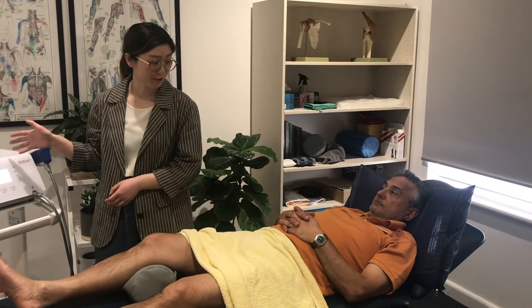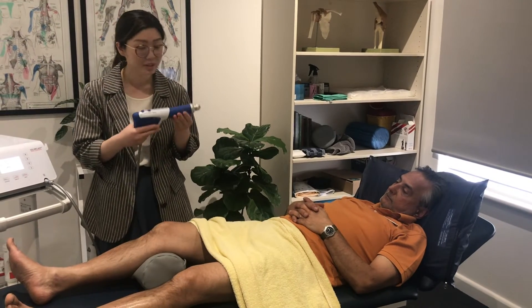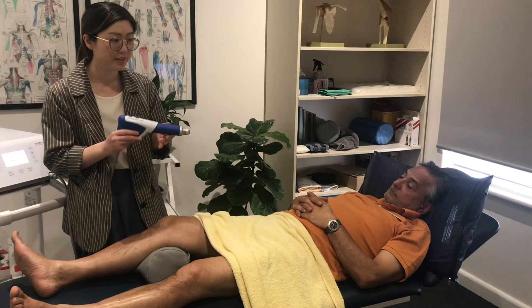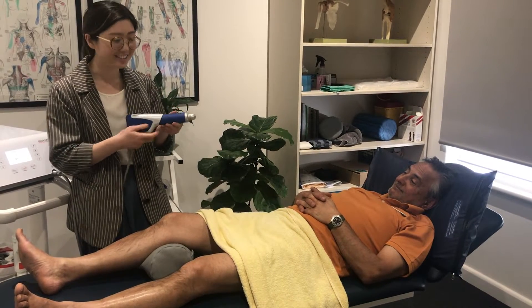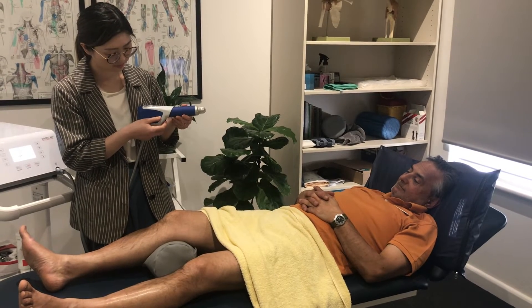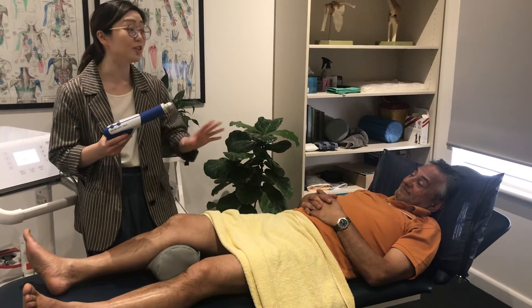This is our shockwave machine, and I'm just going to demonstrate now. This is how we apply it onto the joint or the tendon itself. I'll demonstrate what it sounds like because it can be quite loud. So it sounds like a little jackhammer — acoustic shockwaves.